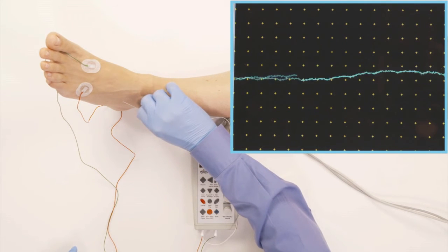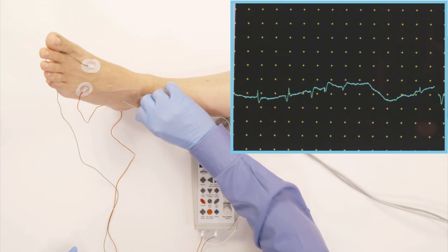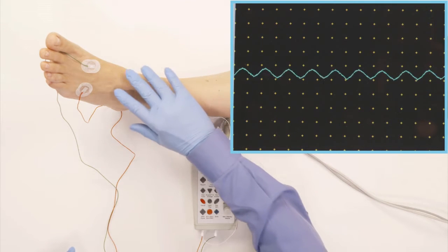I'm going to do insertion, insertion, insertion, and you see the burst, and they always stop as soon as I stop.